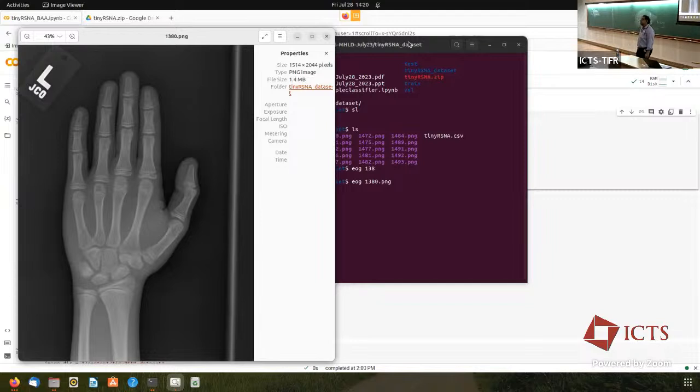Yeah, that's correct. So ideally, you would like to use the validation data to score your trained models, and then use a separate test data to make a prediction score. That is the generalization score of your model.